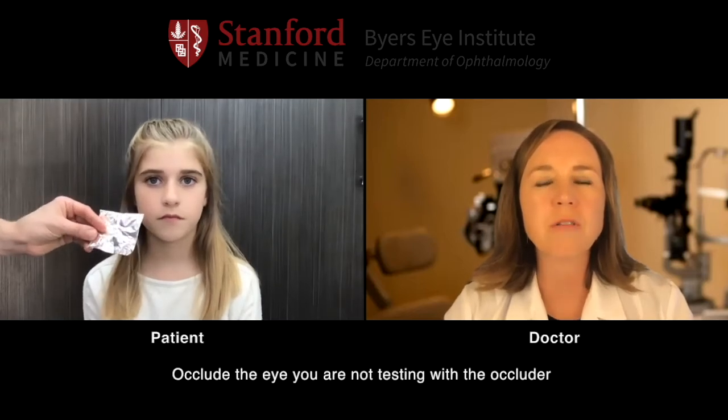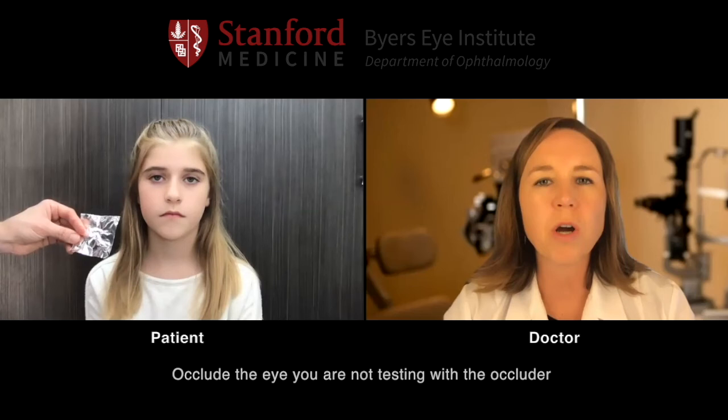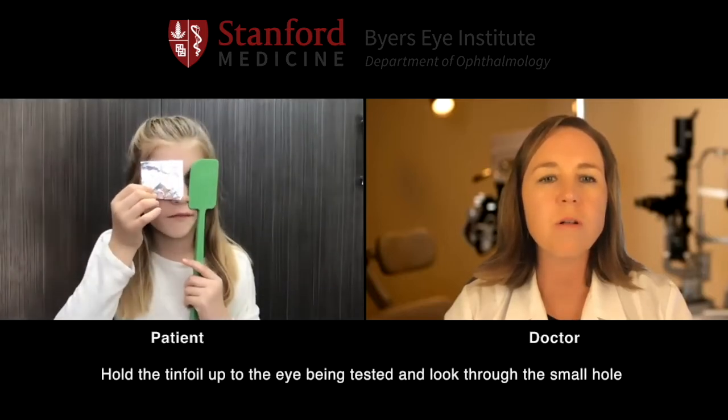Very good. Now patient, we're going to have you cover your left eye with your occluder, and with your right eye we want you to look through that little hole and let's see if that improves your vision at all. Now hold the foil in front of your right eye and look right through that little hole. Does that make it so that you can see a little bit better?